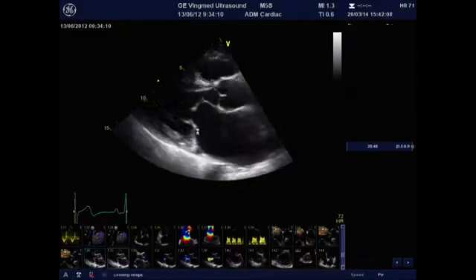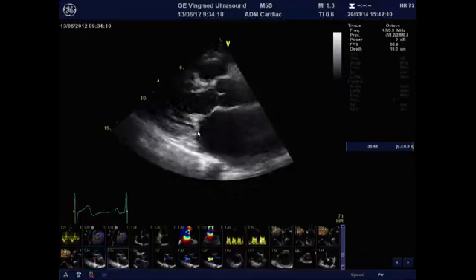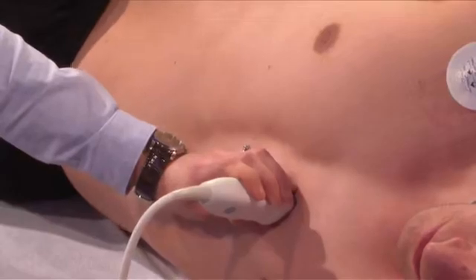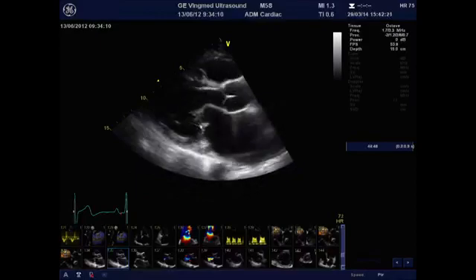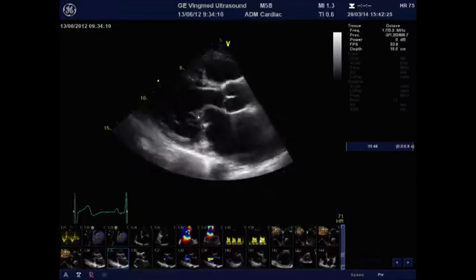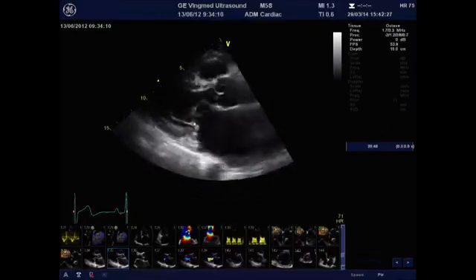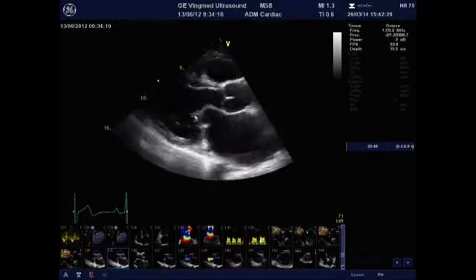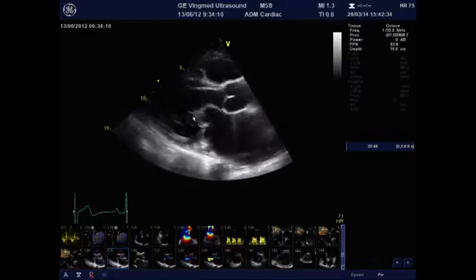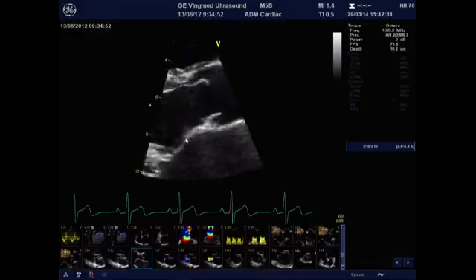mitral leaflet. Further on, if you just tilt the probe toward the medial aspect of the left ventricle, you can already see the fused commissure over here. So you have the anterior mitral leaflet doming in diastole, the restriction of the posterior leaflet, the fused chordae, the thickening of the leaflet tips, and also the fused commissure that you have seen here just by tilting the probe towards the medial commissure. As you know, rheumatic valve disease does not stop at the level of the mitral valve.